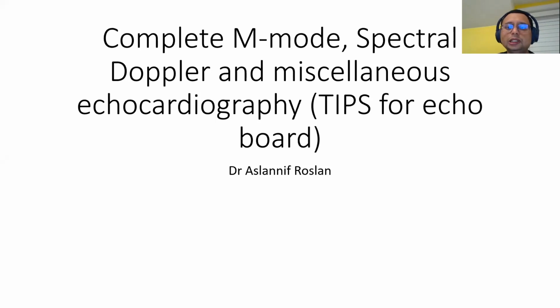The good thing about M-mode and spectral Doppler is that people thought it is difficult, but once you remember all the types of M-mode and spectral Doppler, this is actually something you can easily get points for when you go for the exam. The format of this talk is question and answer, but for convenience, I will answer the question and at the same time explain the thought process behind it, okay?